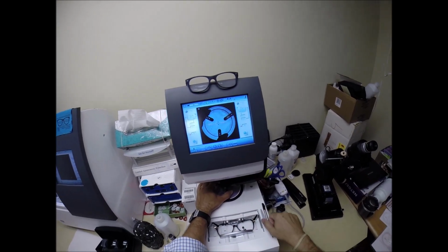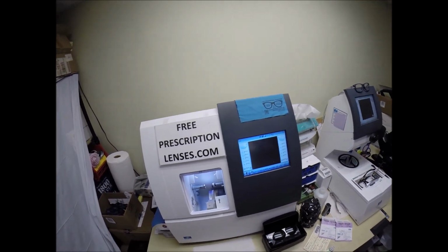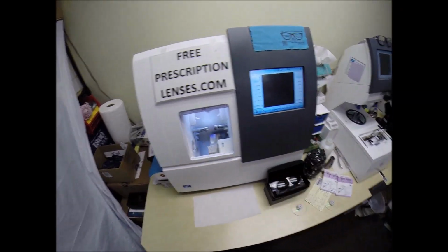Now I'll put the block onto the left lens. So this is the edger. This is what's going to do all the work while I run my mouth. It costs $40,000. It weighs 200 pounds. I recommend everyone go out, buy their own, put it on your own kitchen counter, and you won't need this guy with the two thumbs to tell you bad jokes.